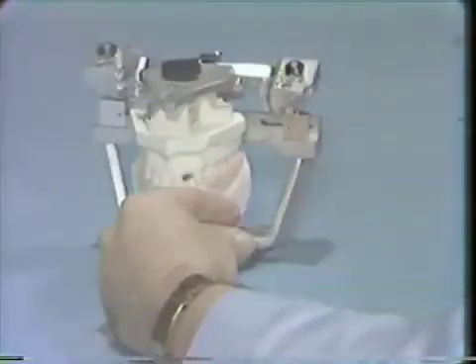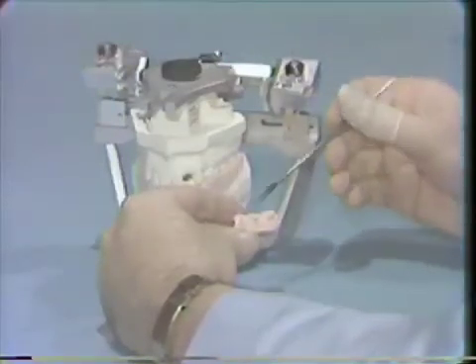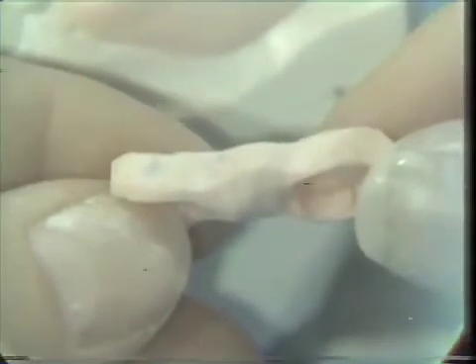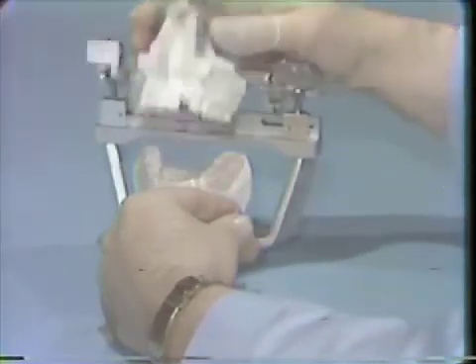We will cut the platform down to the point where only the registration is shown here, and relieve it on the soft tissue so that there's no impingement on the soft tissue, and we can reseat it precisely. We'll now check this material to see if it has attained enough body so that we can remove it.